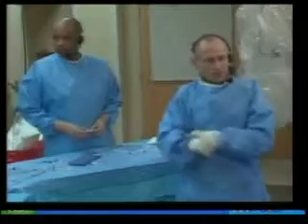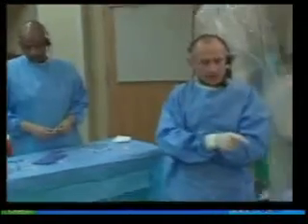Okay. So if I could show you one more thing with the cameraman here, Chris, if you look at the groin, what we placed is a long 10-French sheath. Can you take pictures like that, Kenny? Get ready next door. You can see that we pre-closed this, Chris.